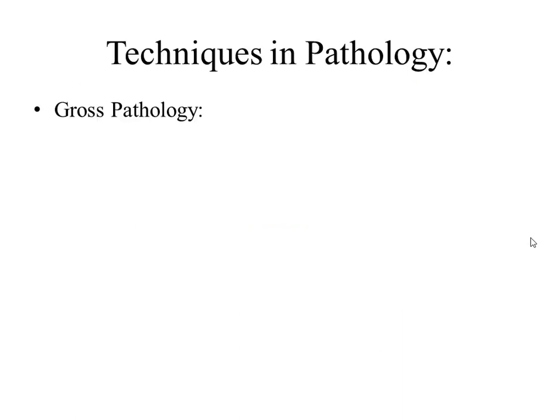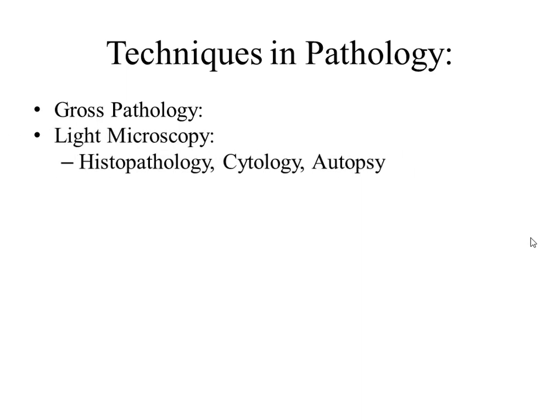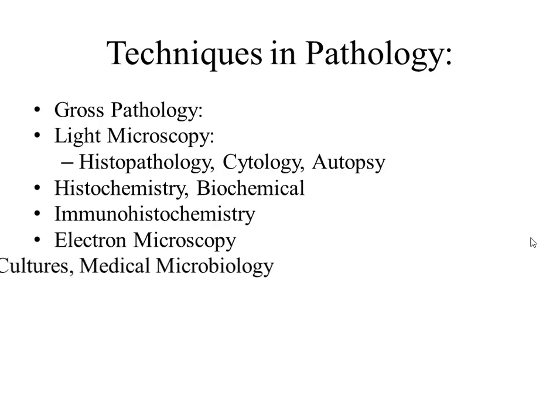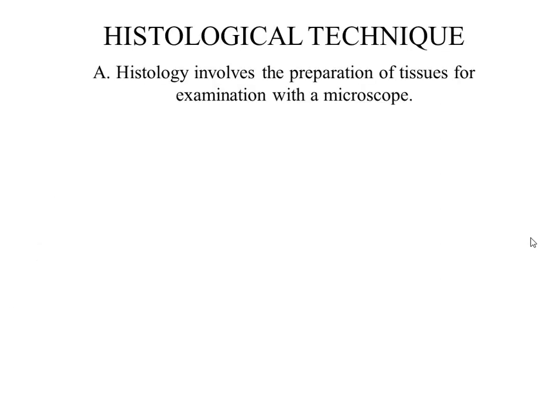Techniques in pathology: first of all, gross pathology with description, light microscopy, which includes histopathology, cytology, and autopsy, histochemistry and biochemical methods, immunohistochemistry, which is very widespread now, electron microscopy, a very deep method, investigation of the ultrastructure of cell cultures, medical microbiology, molecular pathology.